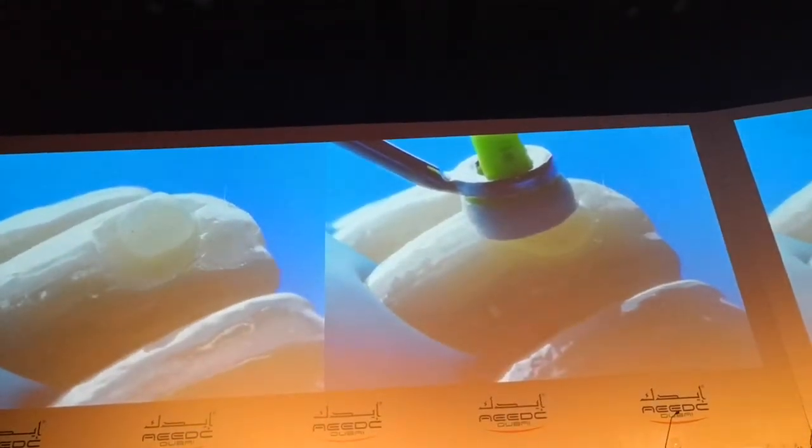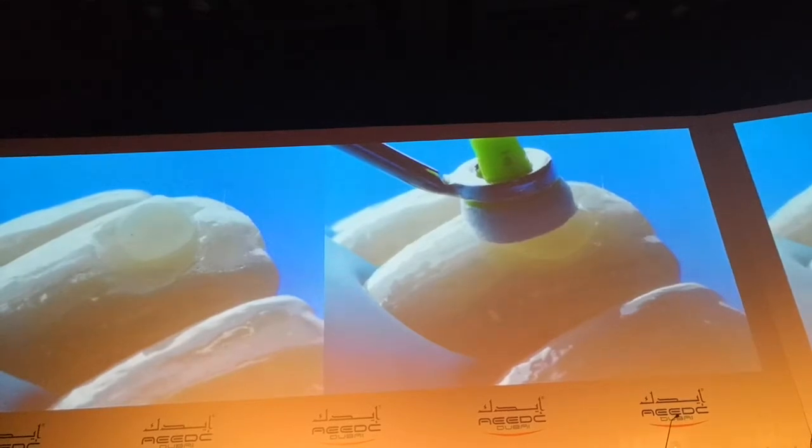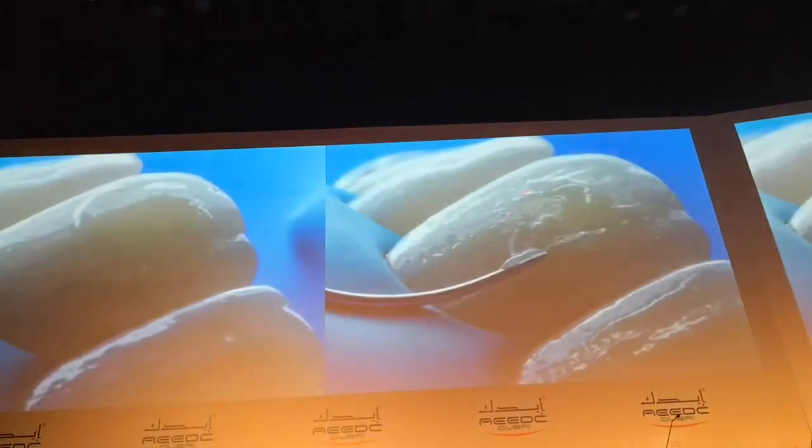And then you cure. That application of the composite — these are very close-up images. Every time there are remnants from the microbrush. And also you have some stains there — this is possible, some plastic deposits, and you need to remove them. And you see that you cannot blend on the surface. So for that reason I use a sable brush — that's why I'm using a sable brush to just place it on the surface.